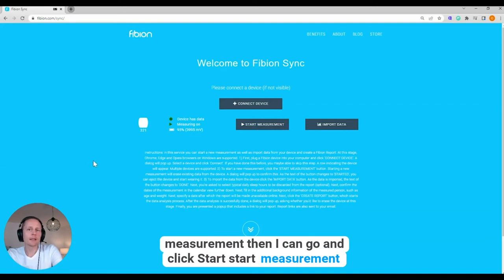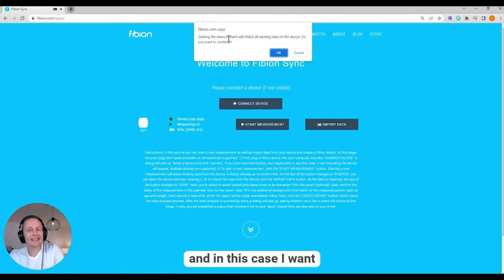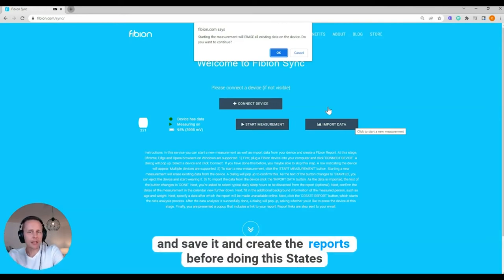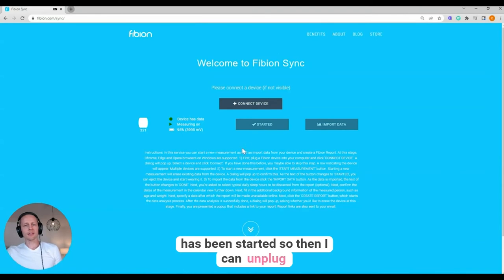I can now click 'Start Measurement.' It will say that starting the measurement will erase all existing data on the device — do you want to continue? In this case I do, because I know there's no important data. If there were, I would go to 'Import Data,' save it, and create the reports before doing this step. Now the measurement has been started.